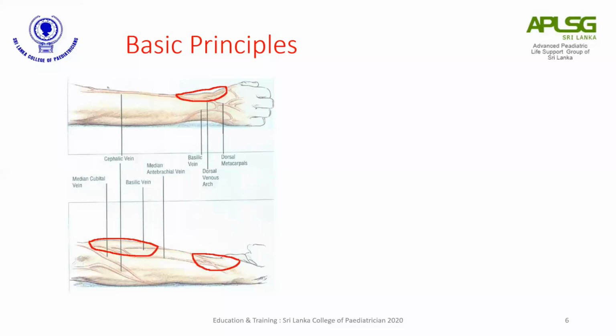You may have noticed in children, there's a practice of splinting to keep the vein stable. But this practice is actually now not recommended because it will deprive the patient of hand function.